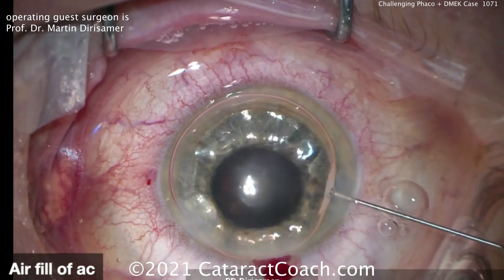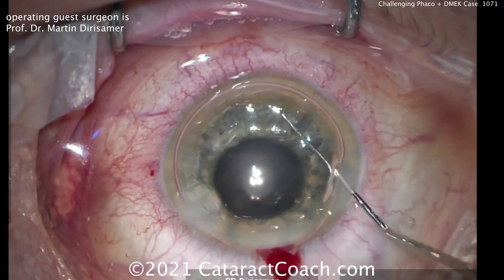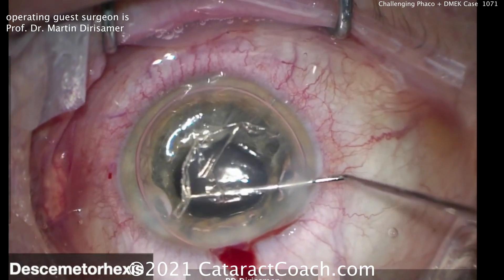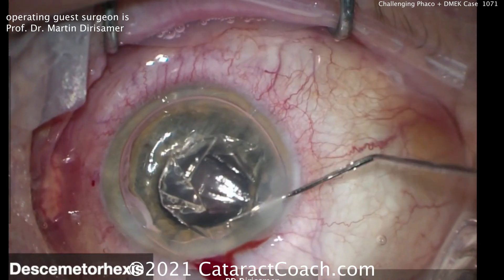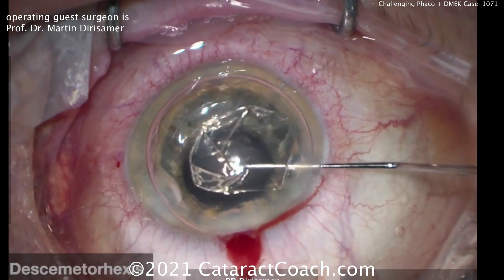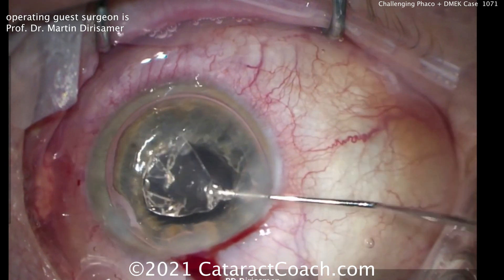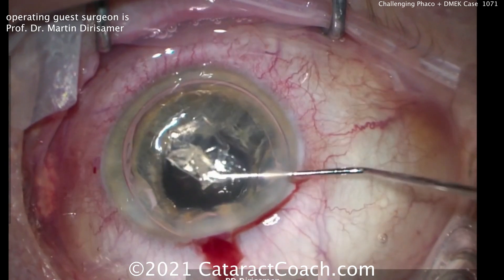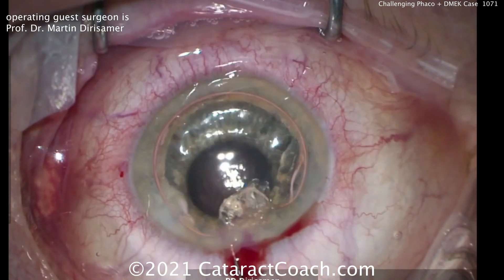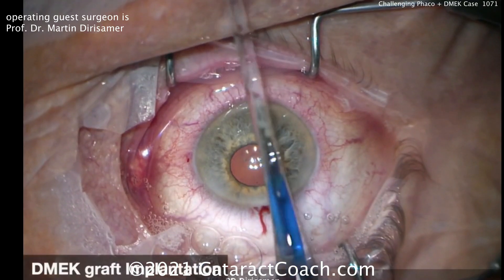There's the air bubble going inside the eye now. Remember, Descemet's was already scored. Now using that Sinskey hook to peel off the Descemet's layer — Desmetorexis — and he makes it look very easy. The challenge is if you don't pivot in that incision beautifully, you'll lose the air and the whole thing will shallow. But Martin has incredible skills and makes it look just so easy. There it is, removed from the eye.